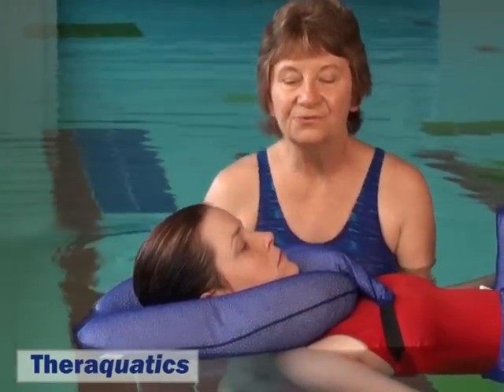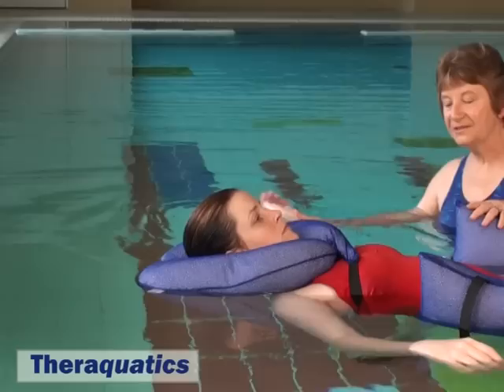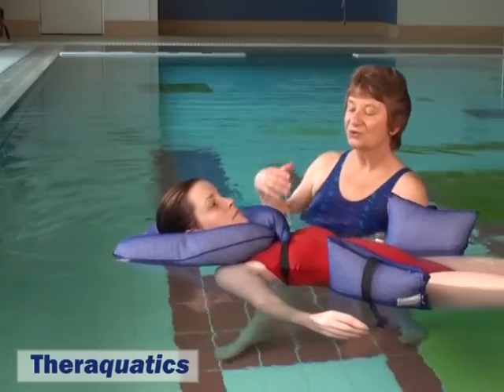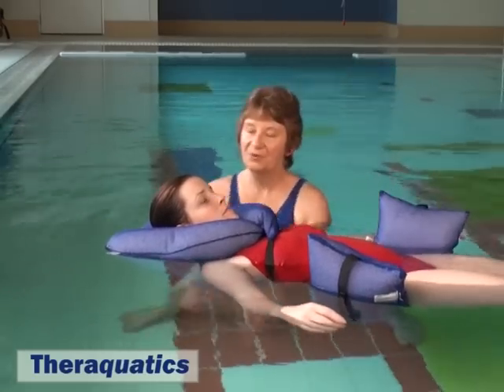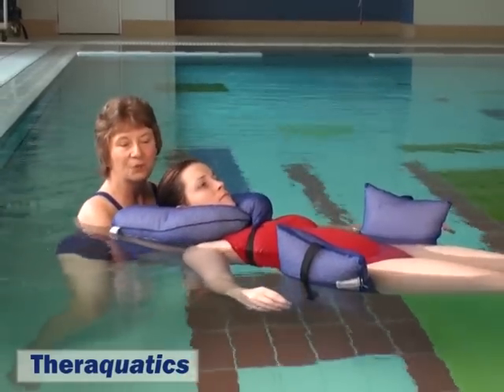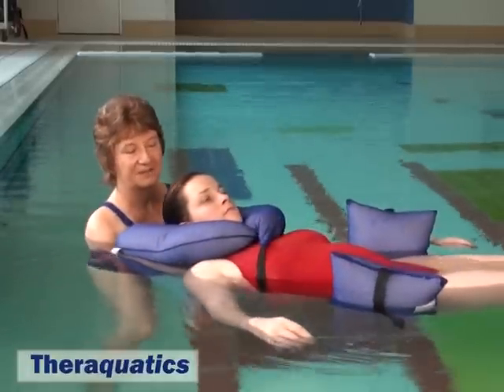There is still freedom around the shoulders and the neck area to allow active exercises and movements with the shoulders and arms, and also plenty of space for the therapist to be able to palpate, move, mobilise and facilitate activity and muscle activation.